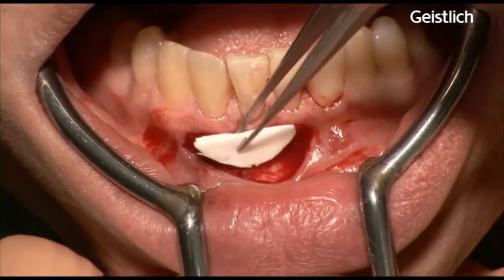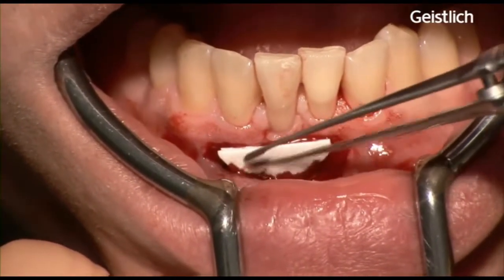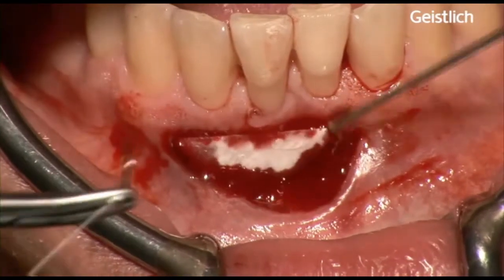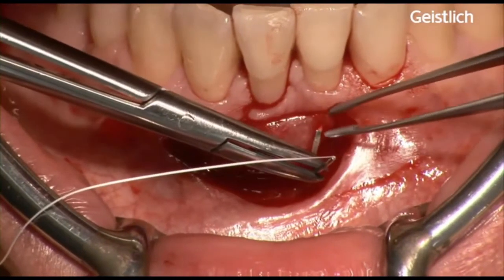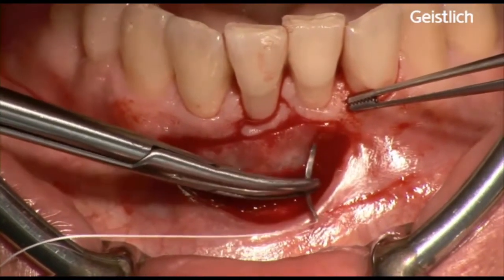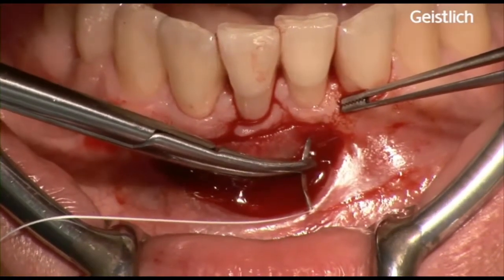Mucograft is placed on the prepared periosteal bed with the smooth surface facing the oral cavity and the porous surface facing bone and periosteum. The matrix is fixed to the small coronal band of keratinized tissue and to the periosteum, and if necessary to the surrounding soft tissues, with non-resorbable, non-irritating 6-0 interrupted sutures. Complete penetration of the matrix by blood and exudates allows perfect adhesion of the device.